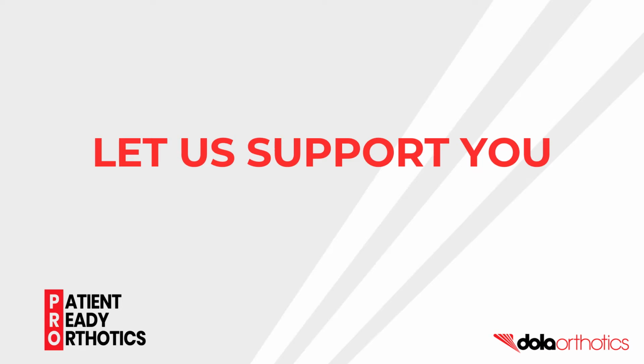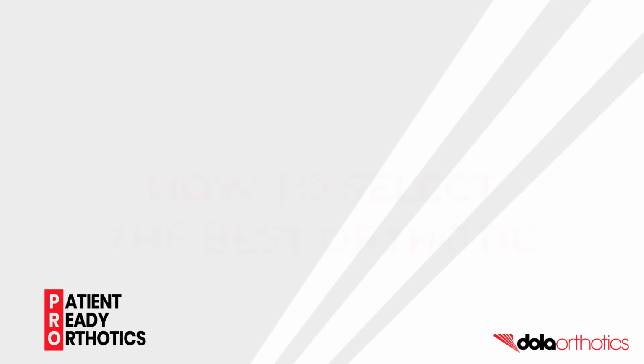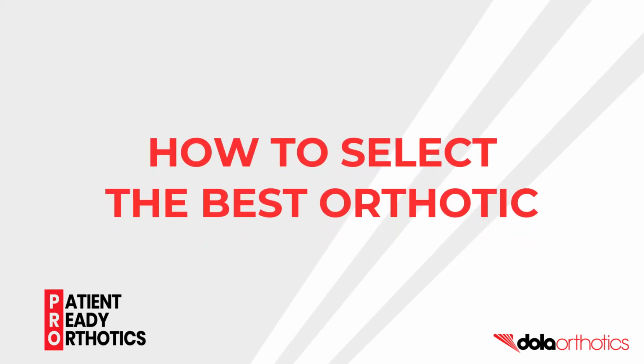If you are unsure which of the 9 patient-ready orthotic styles will best suit your patient, the online selector tool was designed to help you. Tell us about your patient and benefit from over 50 years of clinical and orthotic experience, and let us help select the most appropriate orthotic from our range.